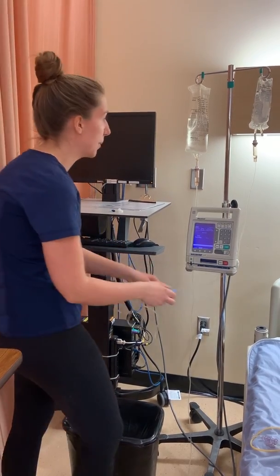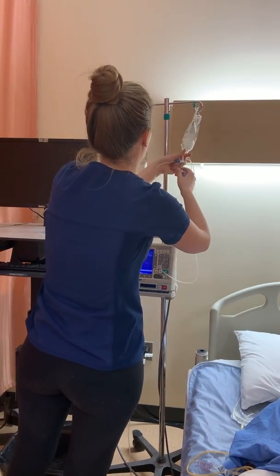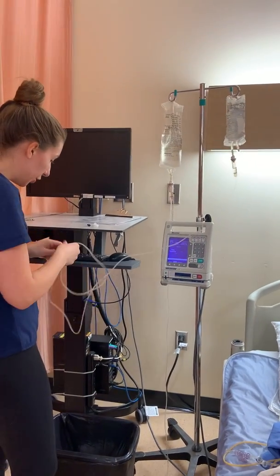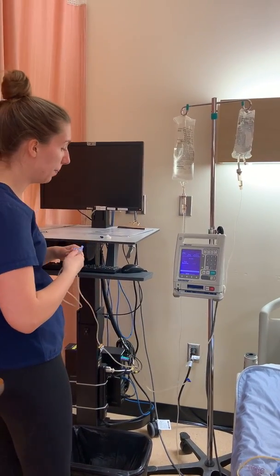Making sure all the clamps are off. And I want my drip chamber 1/3 full. So I'm following along with the tubing, making sure it's all primed. And there's no bubbles, and it is. So I'm now going to clamp it.